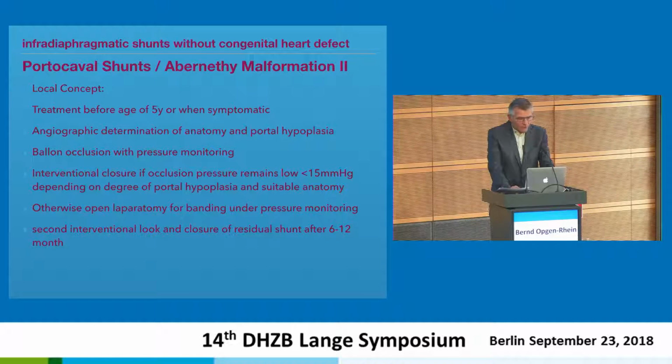In these cases, we go for open laparotomy for banding of the shunt under pressure monitoring, which is done through a microcatheter which we put inside, and go for a second look interventionally with, again, pressure monitoring, demonstration of the anatomy of the portal vessels, and maybe interventional closure.